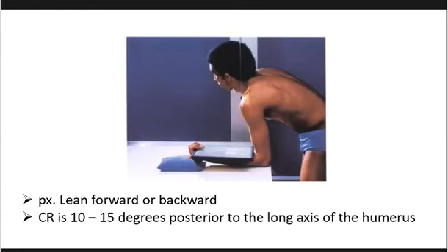One is where the patient is recumbent and the cassette is placed on top of the shoulder to demonstrate the intertubercular groove. This other position, also a tangential projection, is where the patient is erect or upright, holding the cassette, and the central ray is perpendicular.